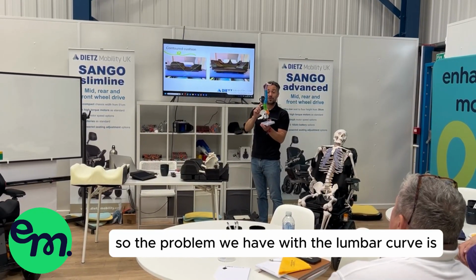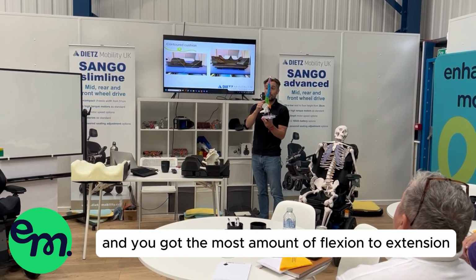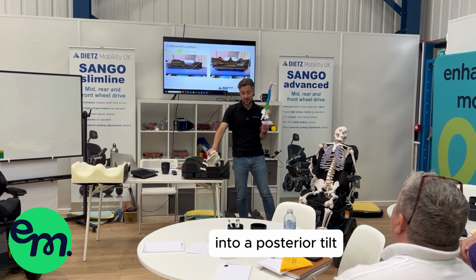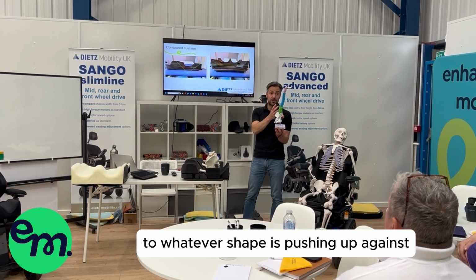So the problem we have with the lumbar curve is you've got the biggest vertebrae in your spine and you've got the most amount of flexion to extension. So if this isn't stabilized properly and it's allowed to go into a posterior tilt, you're going to get the most amount of movement and your lumbar spine will just conform to whatever shape it's pushing up against.